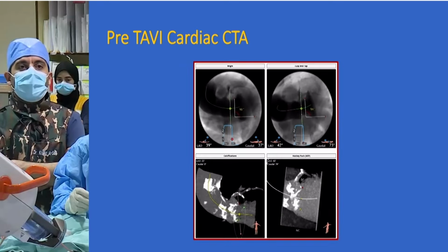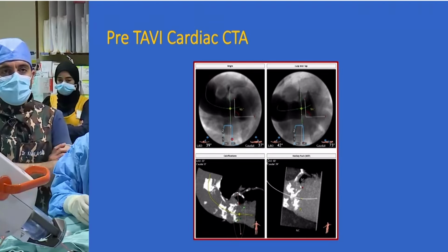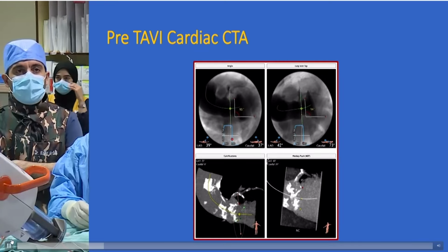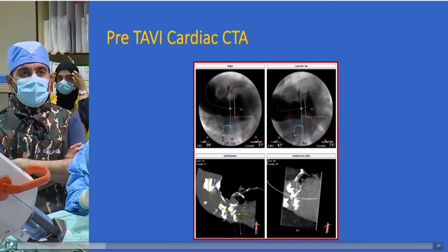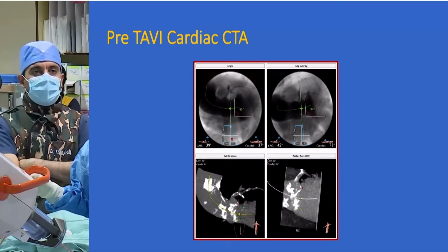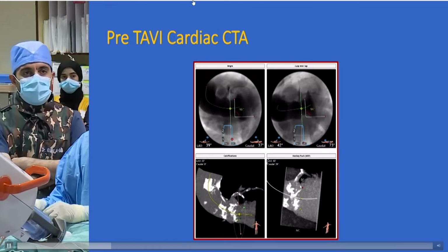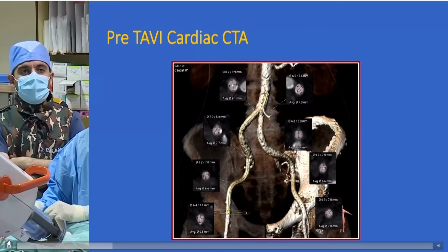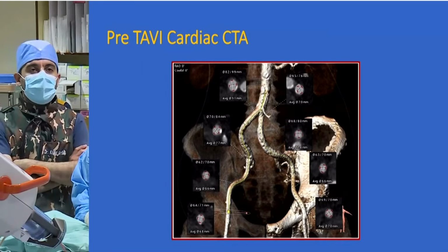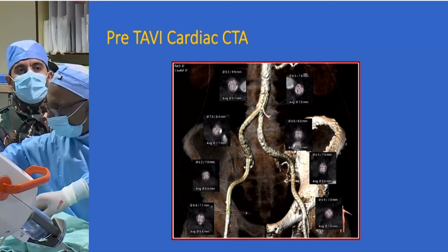Next. Okay, so the main issue we see here is the horizontal aorta, a very extreme horizontal aorta. Here, as you can see, it's a 90 degree aorta, and the angulation is also extreme. So for the cusp overlap, we have an extreme spider view with caudal 73. I think this will be impossible to obtain, but probably we'll be working on the coplanar angle, which is a little bit more reasonable, and we probably can obtain that. Next slide, please. So the peripheral vasculature is okay. We have high bifurcation bilaterally, but in terms of calcification and tortuosity, it's reasonable and size is good. Next.